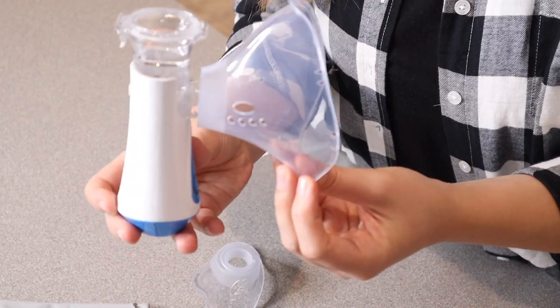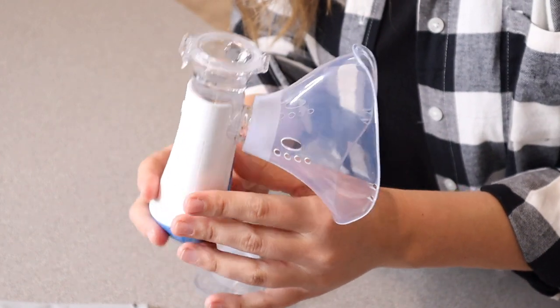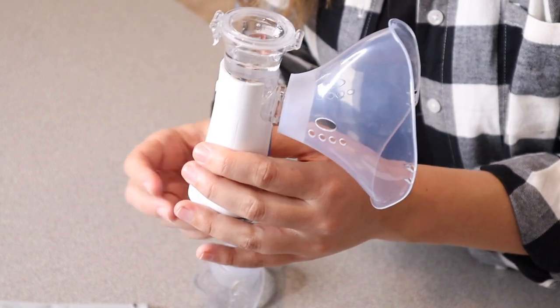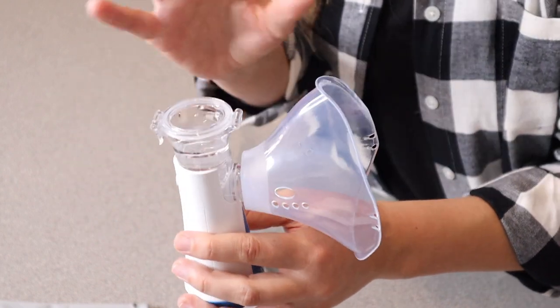Probably my favorite thing about this is that it is rechargeable and completely portable. If you do have this fully charged up, you can just take this with you and you don't have to worry about having a cord or having a big water tank or anything like that — it's just all right here.